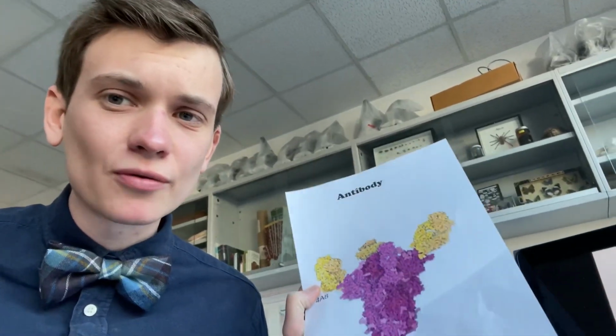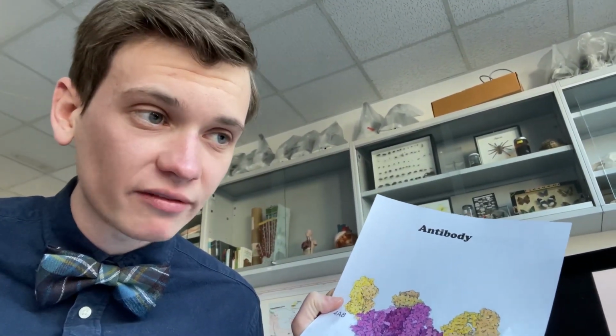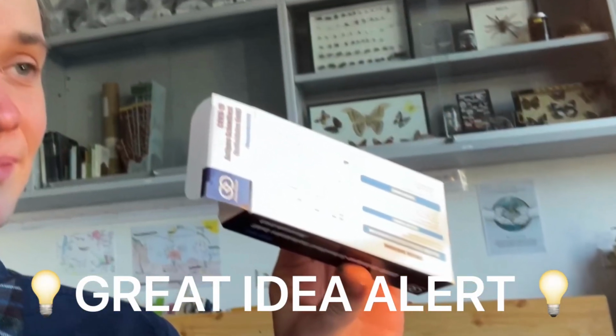That's interesting. So these antibodies can stick to the spike proteins of the coronavirus. That could be really useful. So maybe if we take these sticky little antibodies and we put them inside of paper and then stick that paper inside of a magic little box, then we can actually see if they stick to any coronaviruses inside of our system, and then that tells us if we have the virus or not. That's a great idea. Let's invent it and call it a rapid antigen test.